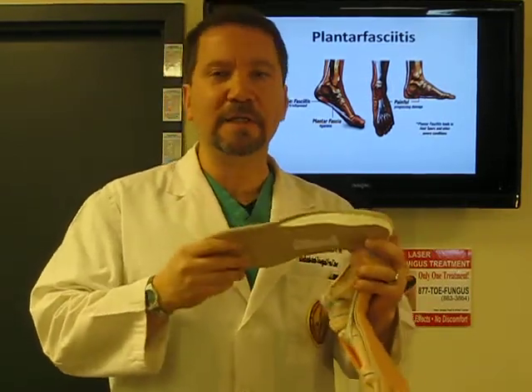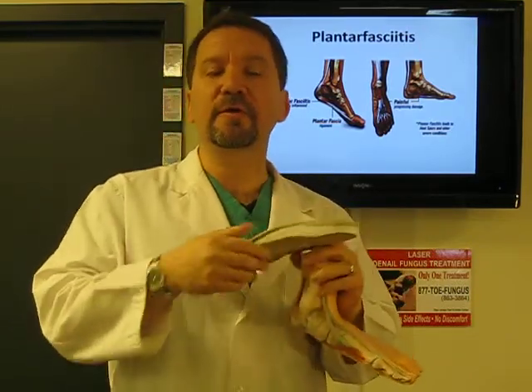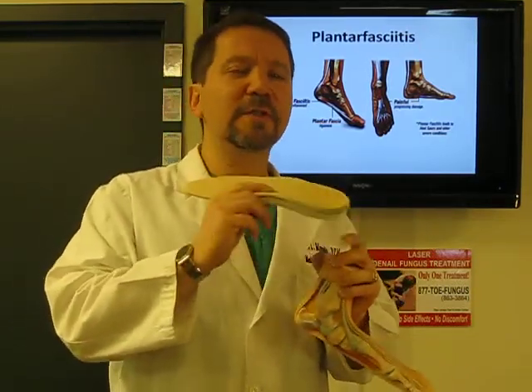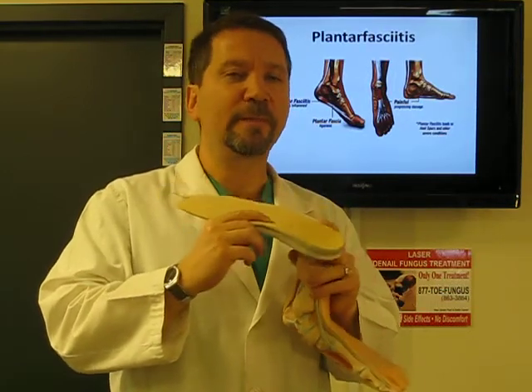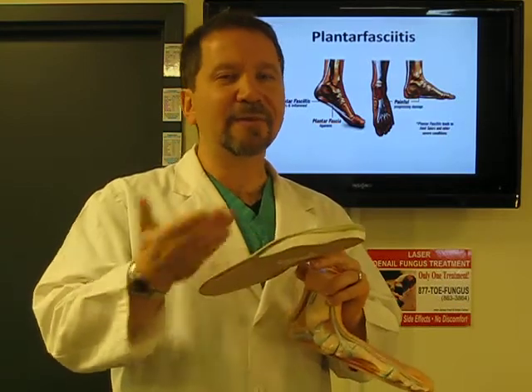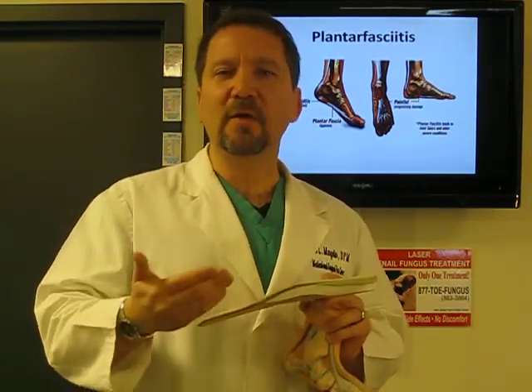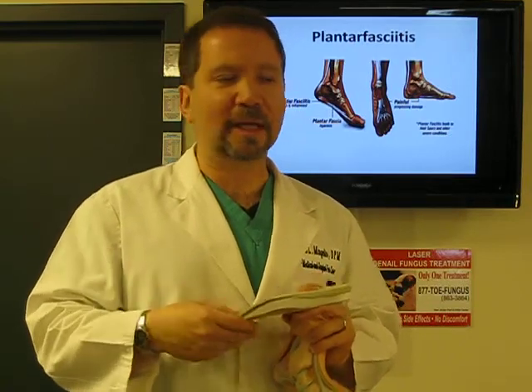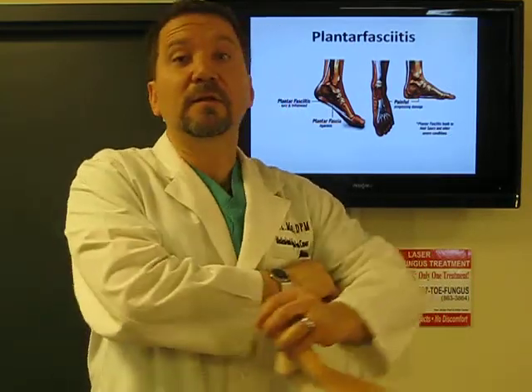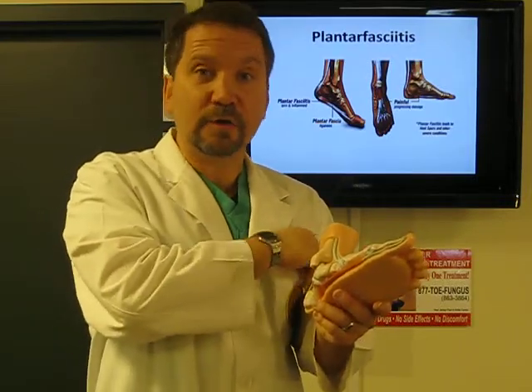Now this is just one example of an orthotic. This is actually a relatively soft one used for runners, used for sneakers, usually used in patients over the age of 23. Before the age of 23 we can use a little bit of a harder material, but after the age of 23 there's already some arthritis that's set in and we tend to go with a little bit more of a flexible orthotic. But what is the main question that I get regarding orthotics is that versus arch supports.